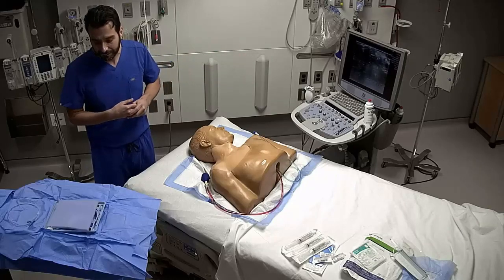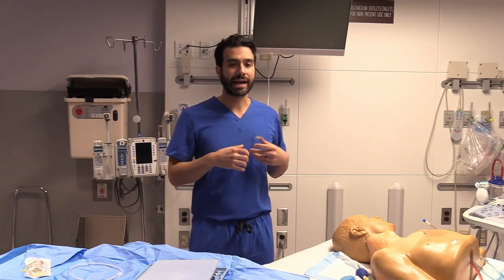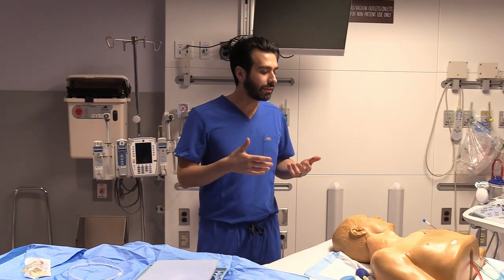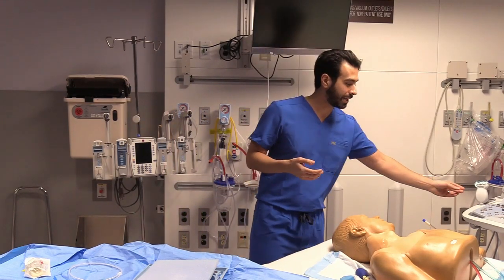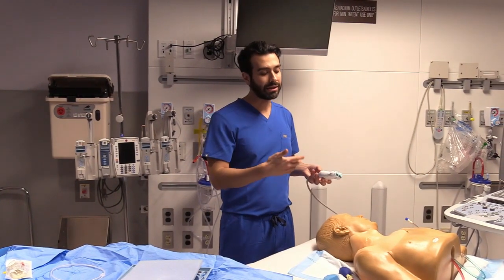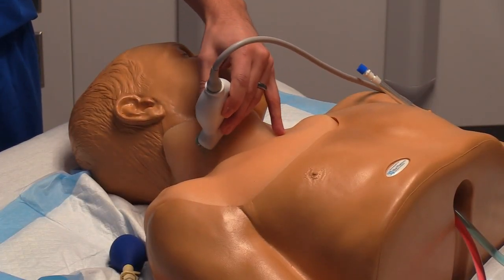probe doesn't fall off. The first thing I would have done is obviously spoken to the patient or a surrogate or a power of attorney or a healthcare power of attorney and gotten consent for placement of the line beforehand. After I've done that, I like to look at the patient's anatomy and decide, am I going to be able to place this line? First, particularly in patients who have had catheters, like dialysis patients, and now they have a fistula. I know that in the past they might have had a dialysis catheter in their neck. So not only confirming the patency in one location, but in several locations.